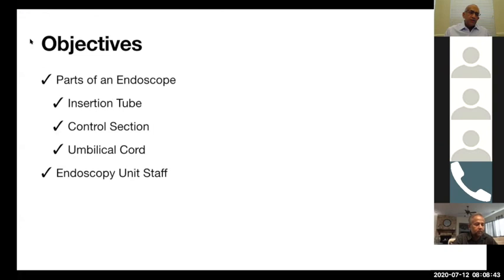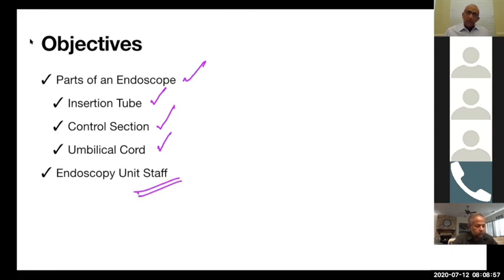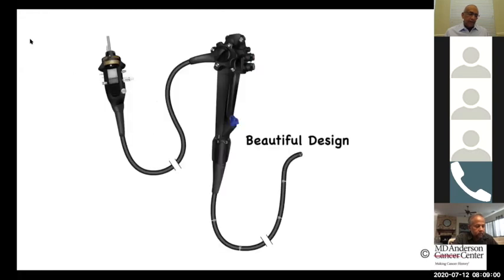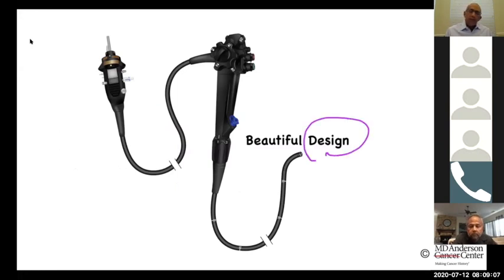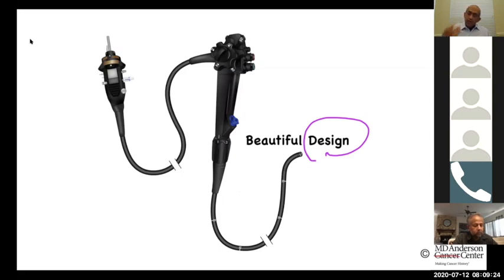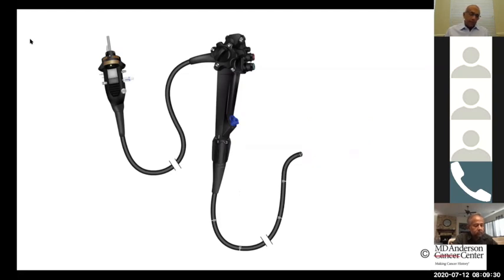Coming to the objectives: we're going to talk about parts of the scope — a little more about the insertion tube, control section, umbilical cord, and the different aspects we need to think about when handling the scope. This is one of the most beautifully designed instruments in the medical industry. This design has been there for almost 50 years, and basically the basic design of the instrument has not changed — which tells you how well the engineers thought through the whole idea.